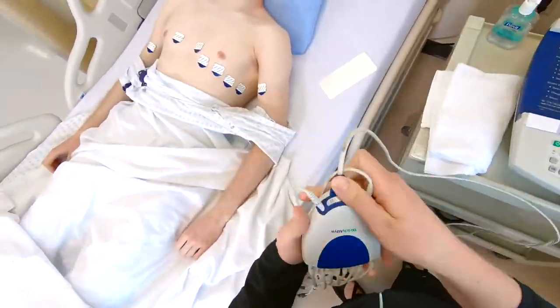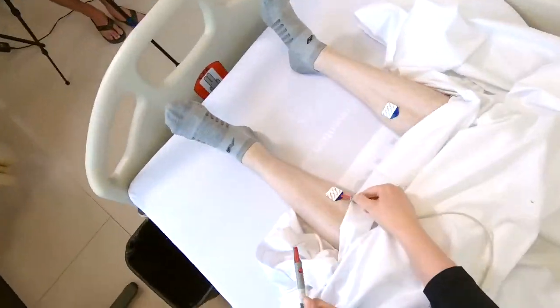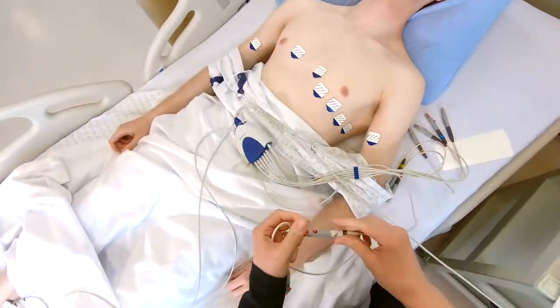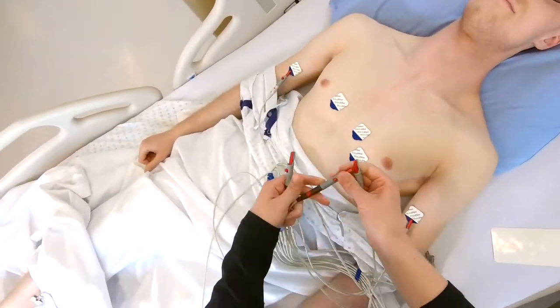Attach the leads to the corresponding electrodes. Each lead should be labelled with the required electrode — V1 to V1, V2 to V2 — and continue until all leads are attached.